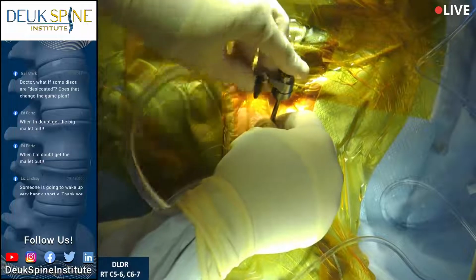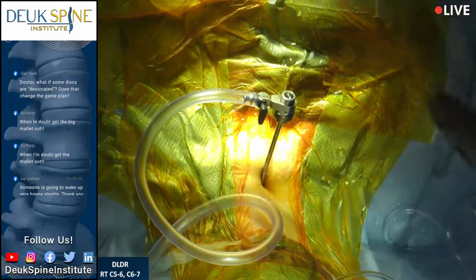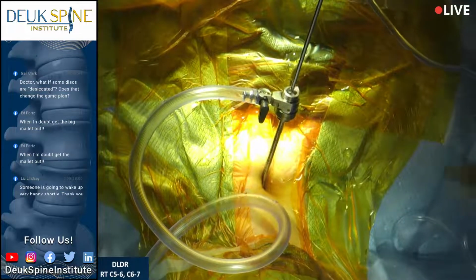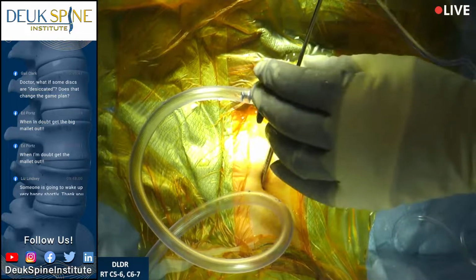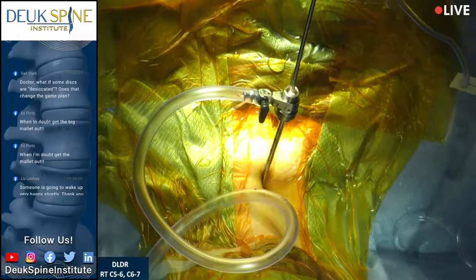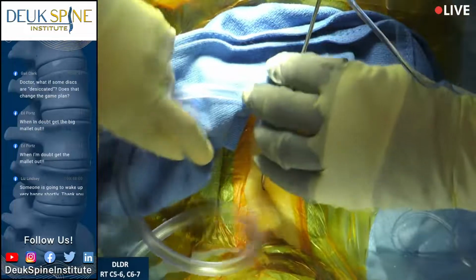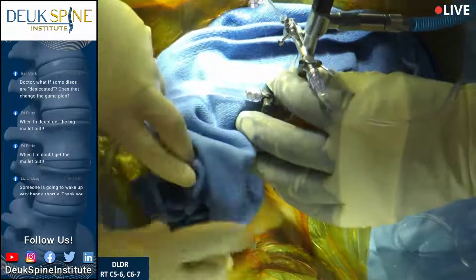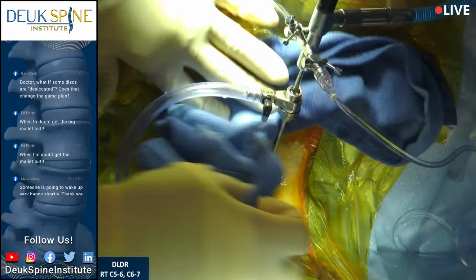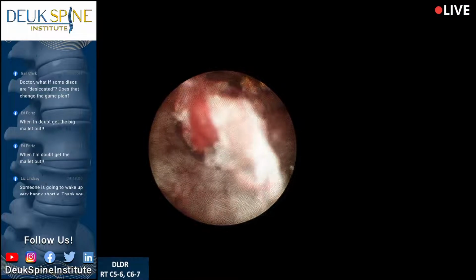Well, let's see if we can get the scope in. If not, we'll have to change out the tube. That may be the problem, why I'm having a stuck tube. Those flanges are bent in. You know how I complain about it a lot with the cervical? Yeah. That may be the issue.